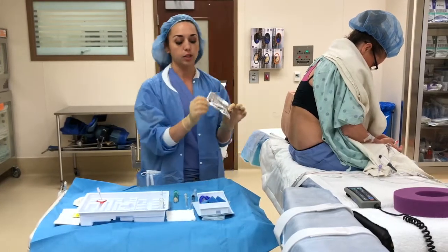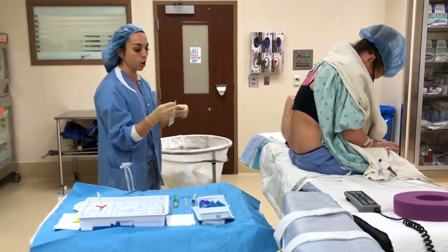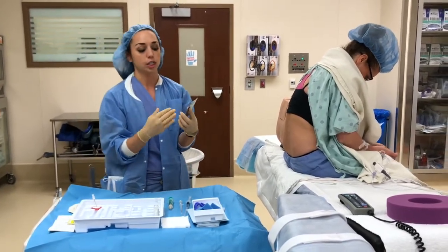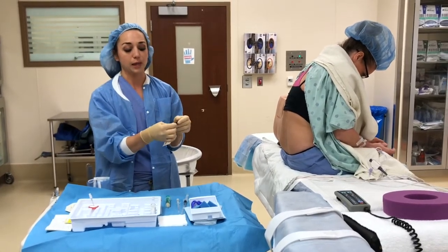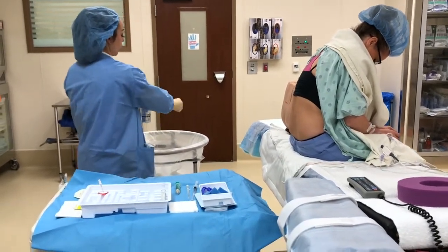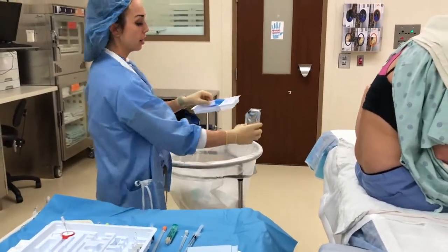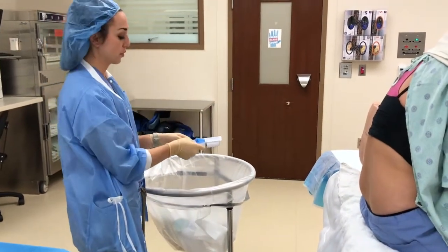Okay, so the first thing we're going to start with is cleaning the back. The povidone-iodine solution that we use at this institution is actually neurotoxic if it finds its way into the neuraxial space. So you want to open it always away from your sterile field. Then you can grab your tray, and pour it again away from the sterile field.